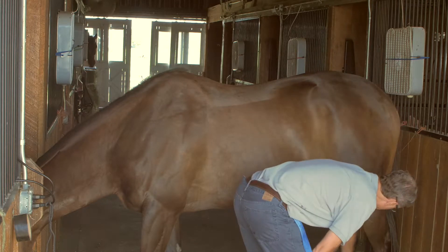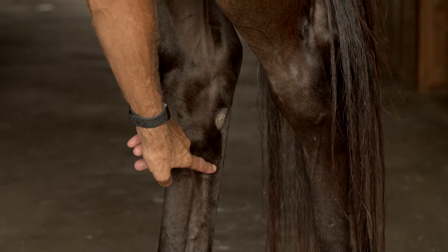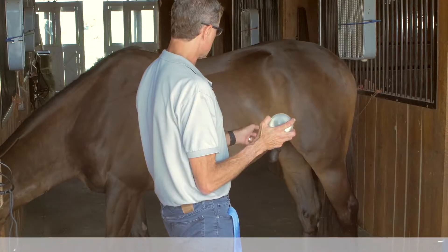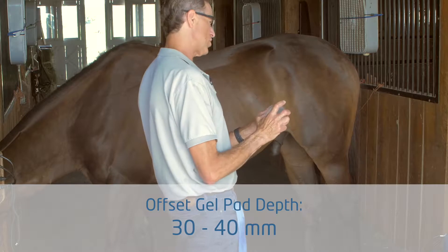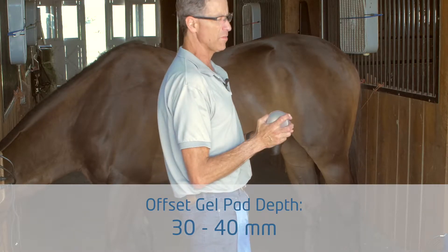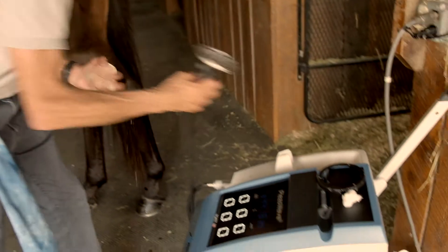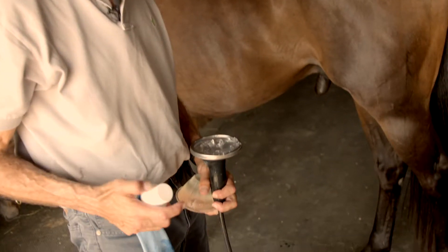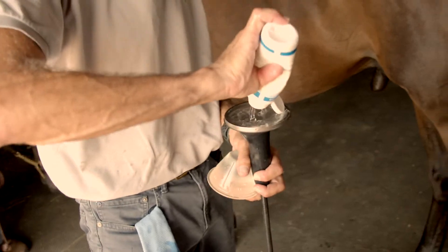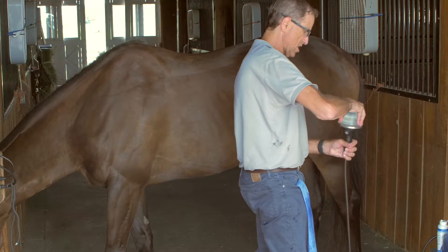The insertion of the high suspensory is accessed through the medial aspect just below the chestnut, and we go in this direction. We're treating an area that's approximately an inch and a half deep, which is 30 to 40 millimeters in depth. I'm going to choose the 40 depth offset. We moisten it — there's a little bit of leftover gel from the previous treatment, so I'll top it off with just a tiny little drop. That's all you need. Get a nice film.